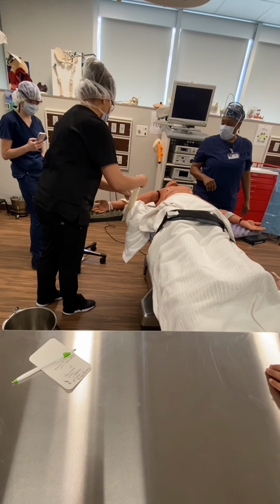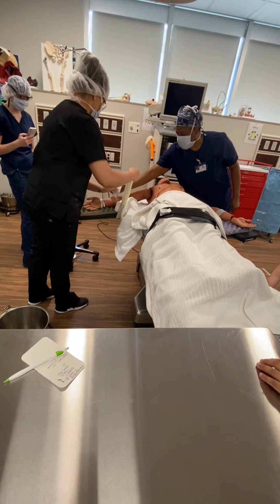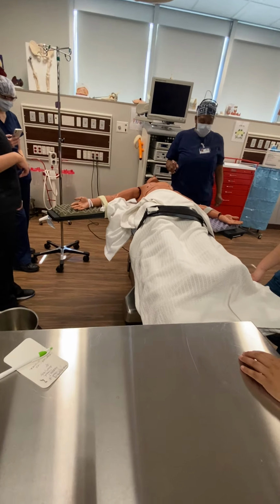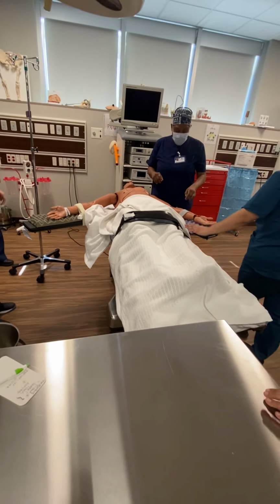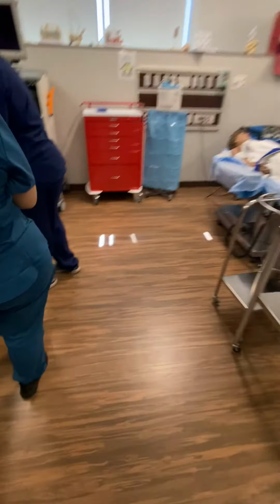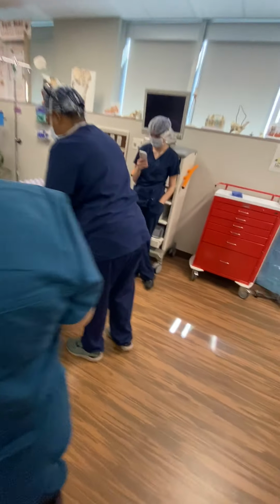Oh, wait, so is it up here that I want it? You use the bottom on the wrist? Yeah, it can be down there at the wrist. Okay. And you're going to take it off, okay? And then we take this out, and you can move the patient's arm right by their side.